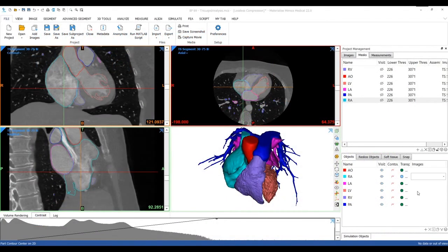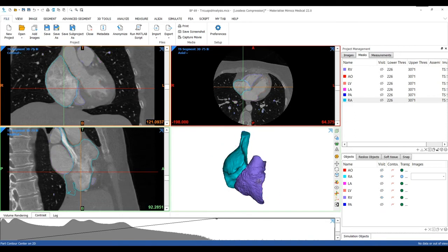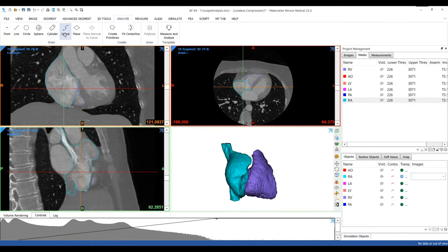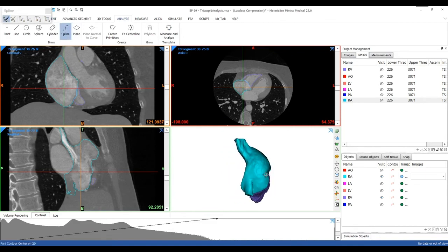Let's switch to the Mimics Innovation Suite. The segmentation of the heart has already been performed by using the CT heart tool as explained in other tutorial videos. We'll hide the parts that are not of interest at this point. To analyze the tricuspid annulus, we'll first indicate the annulus by drawing a spline. For that, we'll go to the Analyze menu and select the Spline tool. I will make the indications on the 3D model, but you could also do the same on the images.